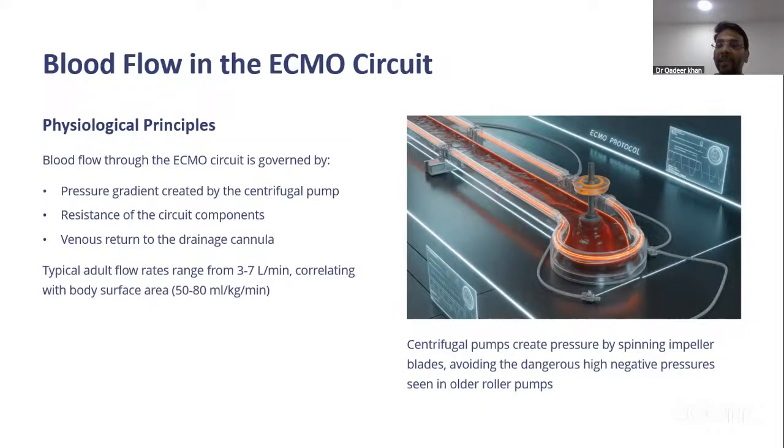The centrifugal pump creates a pressure by spinning the impeller blades inside it. It avoids high negative pressures when compared to the roller pumps, which create high negative pressures. The next thing we need to know is that centrifugal pumps are preload and afterload dependent. So if your preload and afterload change, then the flows may increase or decrease. In contrast, the roller pumps which were used previously are not preload and afterload dependent.